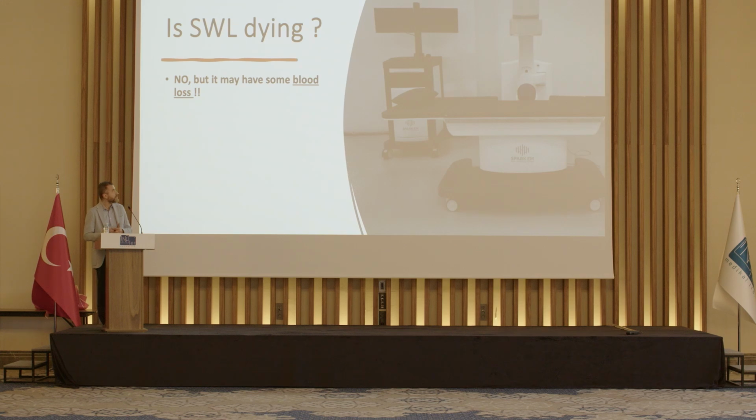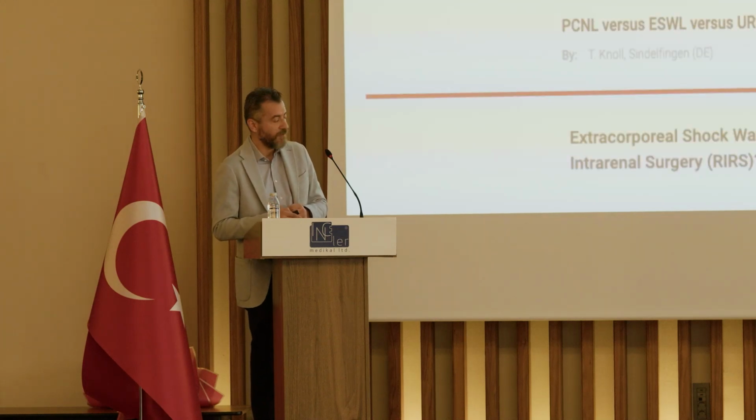However, this question: is shockwave lithotripsy dying? The definite answer is no, because it still has a good role. It's a very cost-effective treatment, but certainly we use it less and less in recent years.